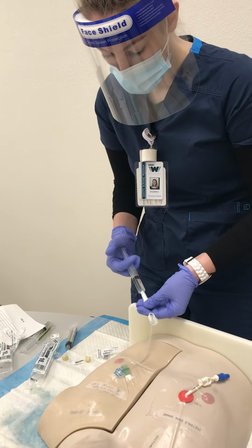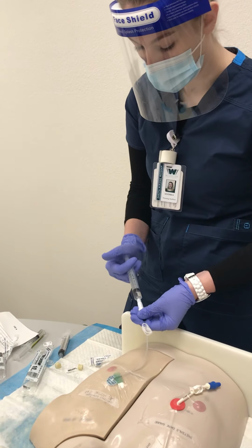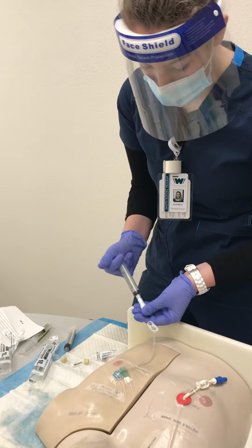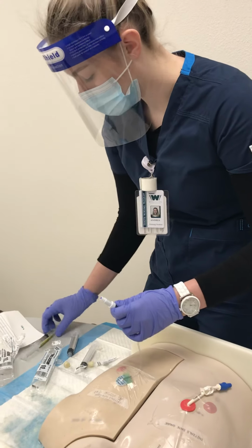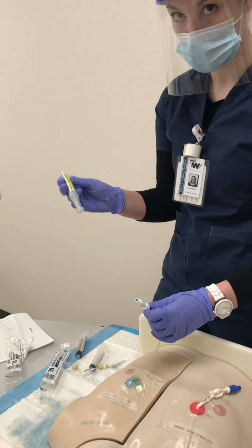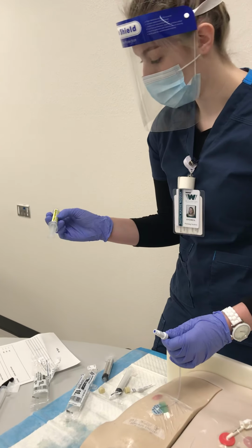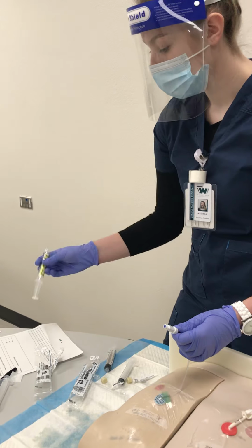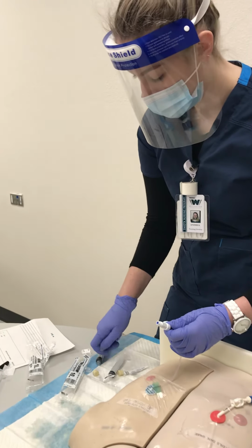So we want to do the push pause method every time we administer something into the central line so that it creates some turbulence. And then hold our hand on the plunger while we lock it and undo this. So lastly, we have our heparin, which I've already verified with my nurse. I'm just going to do my last check to make sure that I'm okay to give this heparin. So it's heparin IV flush, 500 units per 5 milliliters. That matches with my MAR, and this is set at 5 milliliters like my nurse already verified.